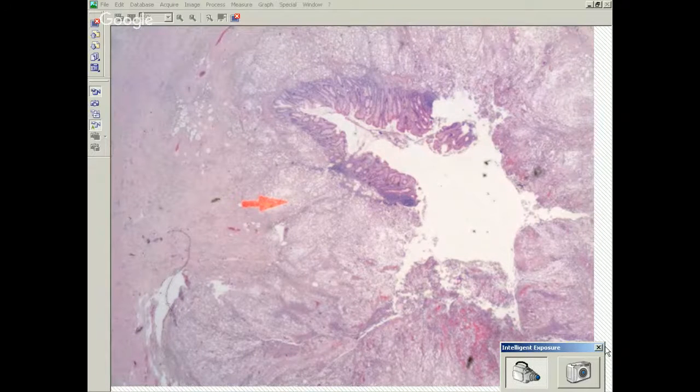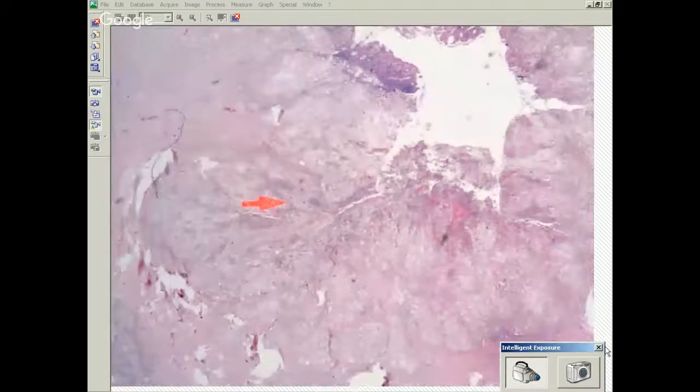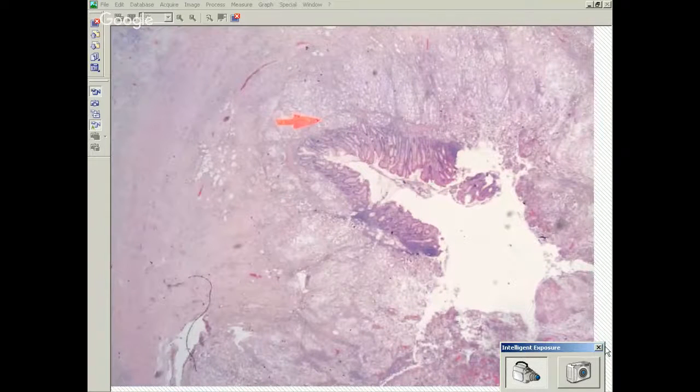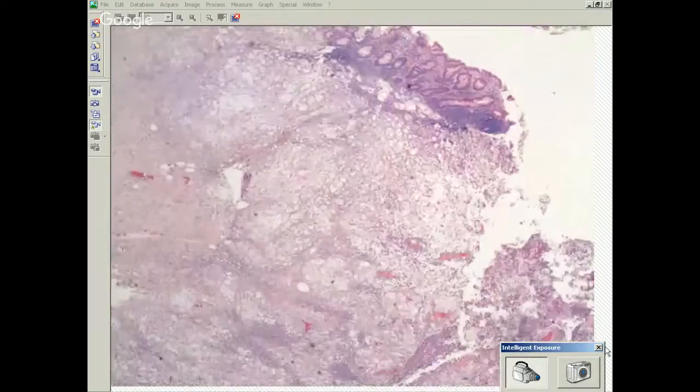So there's a lot of expansion. It seems like empty spaces. Okay, low power. Probably mucinous. Okay. So you're thinking mucinous. Okay. There is an expansion. It's kind of in the submucosa, where the submucosa would be, right? And let's look to see. So if you're mucinous, a mucinous lesion would be in the differential here.